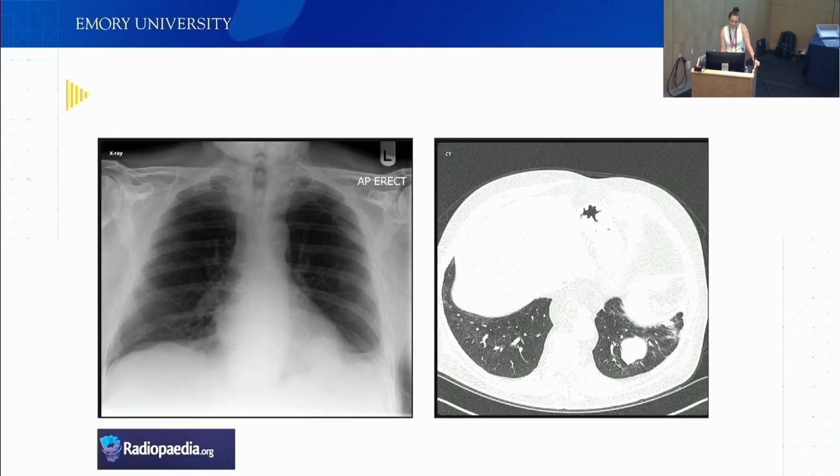Just one comment on this one. You're going to publish the report as AI is better than radiologists. That's not a true apples to apples comparison, because they would also pick the abnormality on the CT scan. I think that was a common mistake earlier on. This is a great use case where you find a good machine-human combination, but if you start publishing that type of work, then it builds a little bit of distrust in the radiologist, because it's almost like more than the combination that's there.